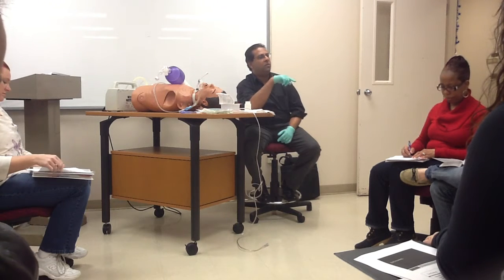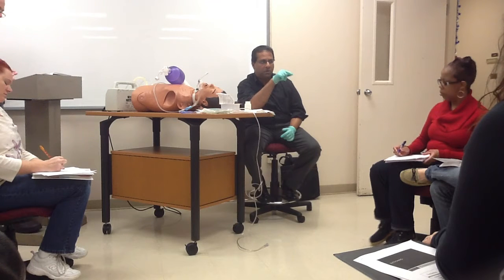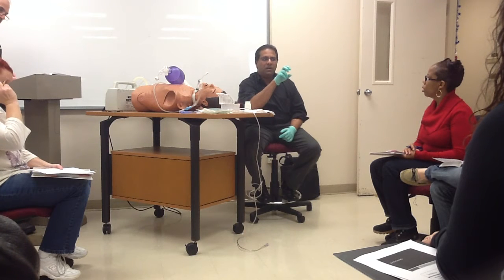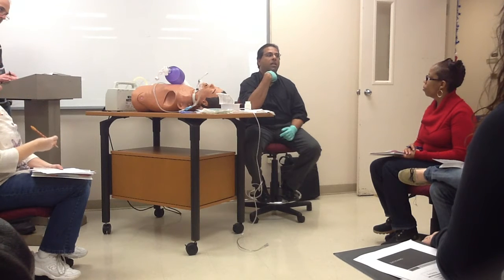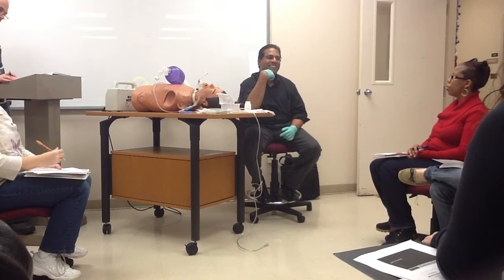Well, how do you know? Now that's a good question. Which one are you going to use, a 10 or 12? I want to make sure it's going to fit. A larger one's going to suck more. Yeah, the larger one will suck more. The problem is it's going to block the airway. Okay. So is a 10 better, if you have an 11?